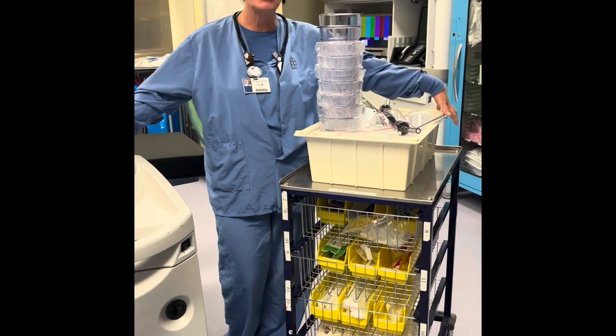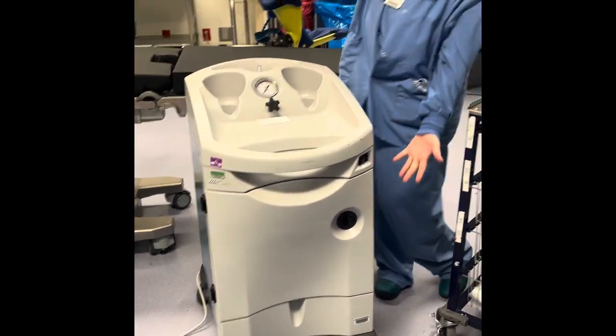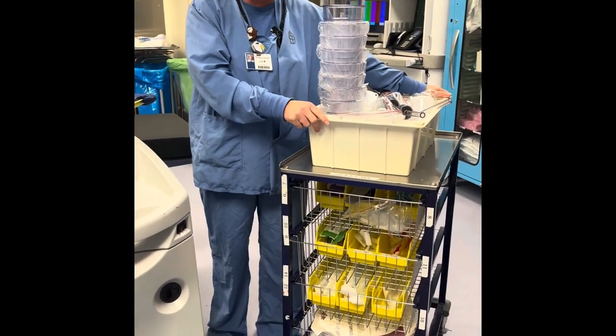Hi, good afternoon. Welcome to our new fancy schmancy D&C machine. Today we're going to teach you how to put all the pieces together.